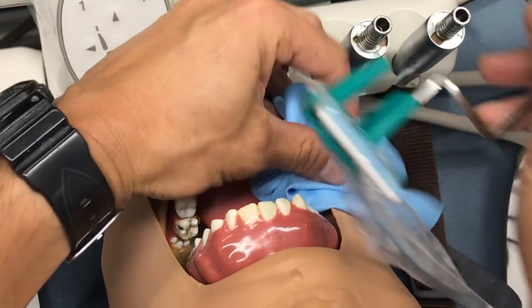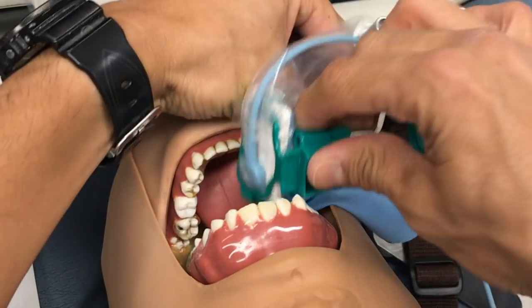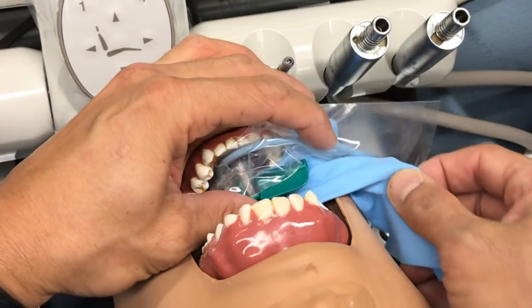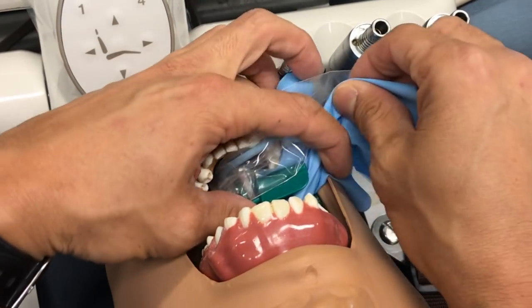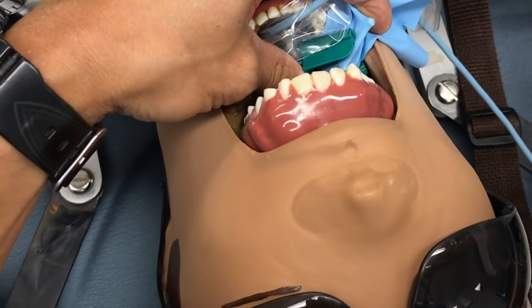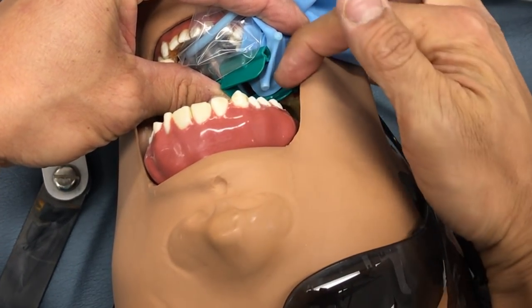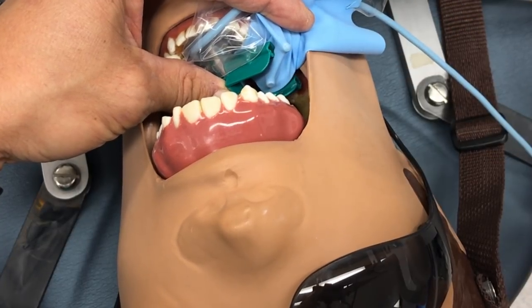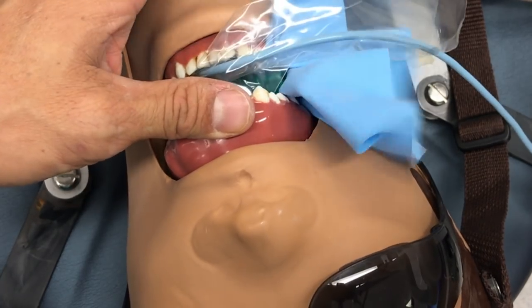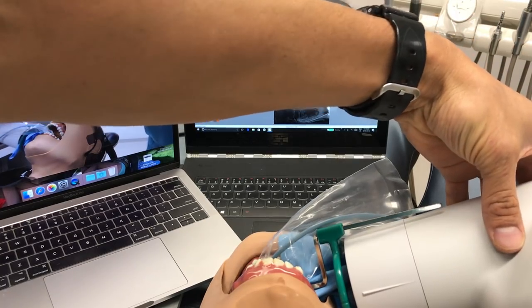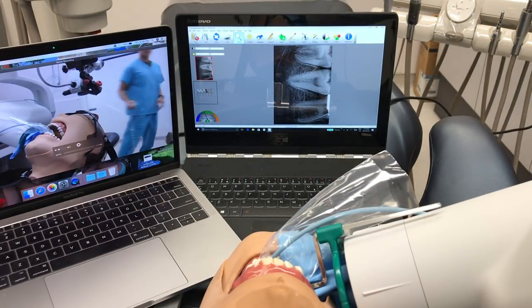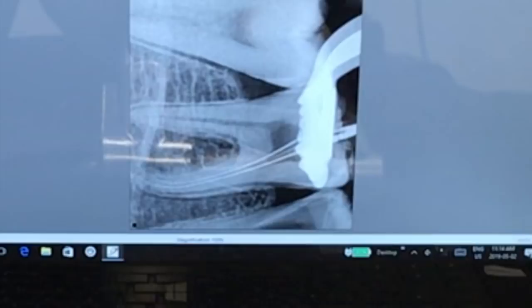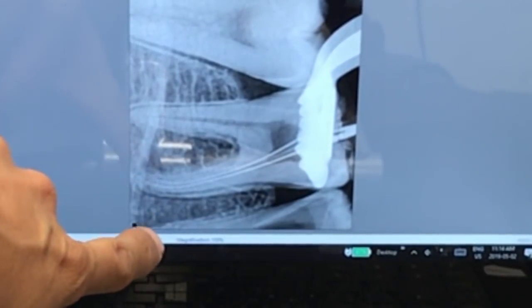My endo mentor taught me that tip many years ago. Let's go ahead and place our sensor into Dexter, making sure the rubber dam clamp is visible. The reason we use this setup is so that when the patient bites down, they're biting on the plastic and not our files. Let's line everything up and take a straight-on radiograph.